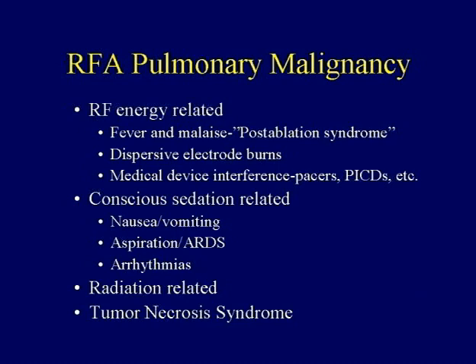Just from the RF energy, we've observed that there's a whole syndrome that's attached. This has been well described in the use of RF ablation in the liver with colon metastases, the post-ablation syndrome, or some fever and malaise. You have to be careful. The energy burns can be quite painful, and this is something that needs to be observed during the procedure. And one of the things you always need to remember with RF ablation techniques is if there are medical devices that are electrophysiologic in action, there can be disturbance between the two.